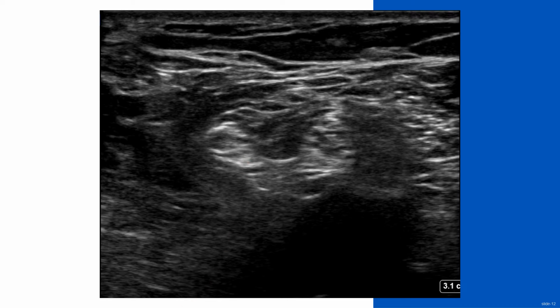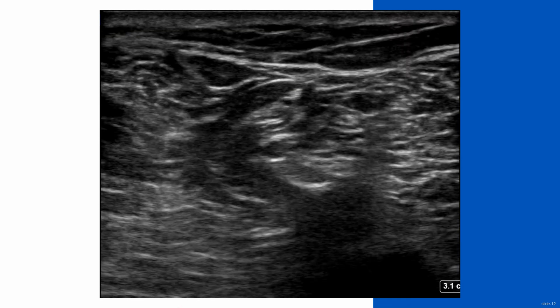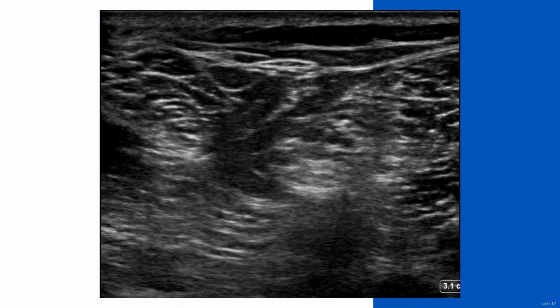Let's start it again. Here we're coming proximal again. And you can see that they have become essentially one nerve structure. They do run in that common paraneural sheath, however, so you need to get your local anesthetic inside that sheath to get a good block.